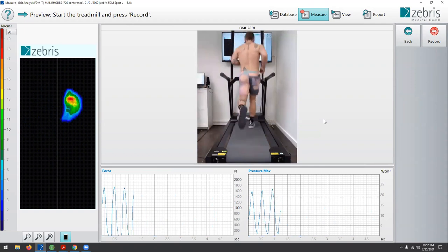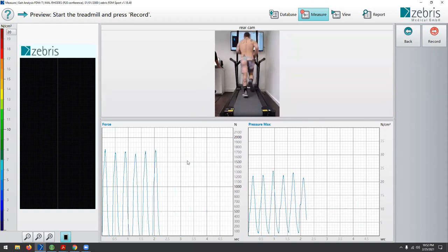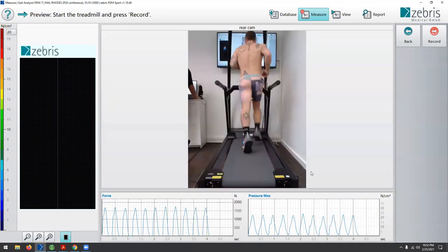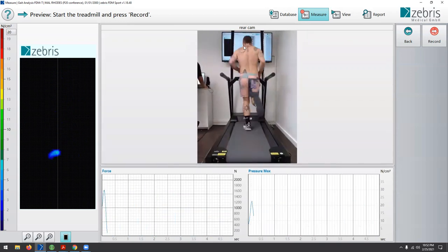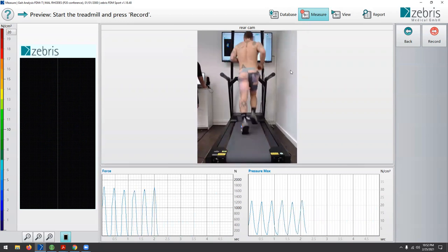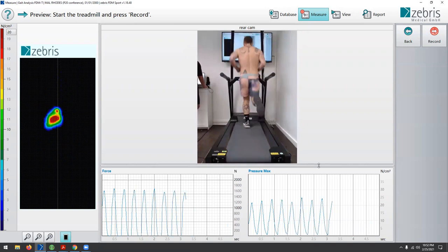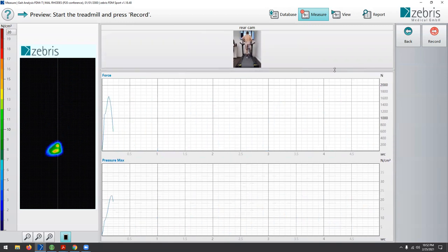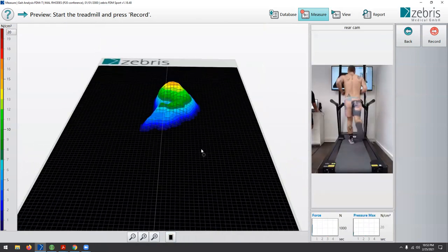I've got Mel running here at six-minute pace, just warming up. You can see the Zebris treadmill is giving us a live feed of force and pressure. We also have a camera looking at posterior capture. I often have a TV screen in front of the runner so I can demonstrate exactly what they're seeing. Sometimes I'll turn it off if I don't want them to change their gait parameters, but more often I'll get them to look at what they're doing. If I'm using gait retraining, I may get them to try to reduce that peak force as they run.